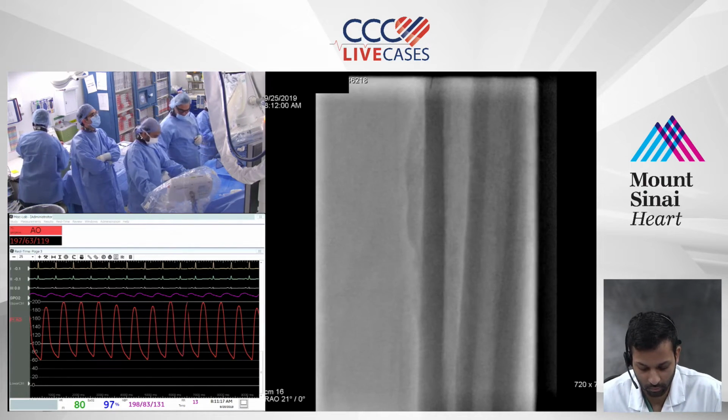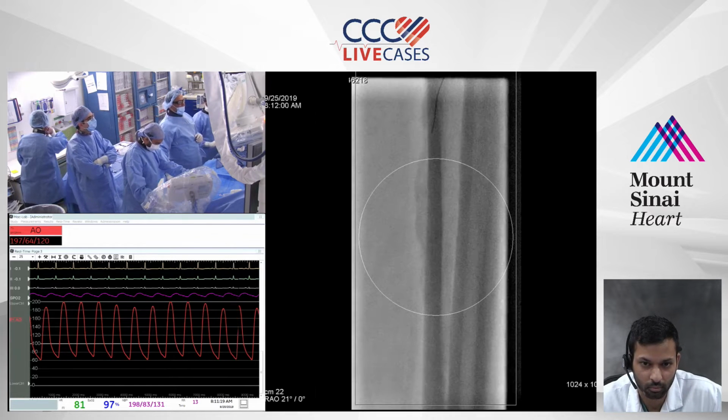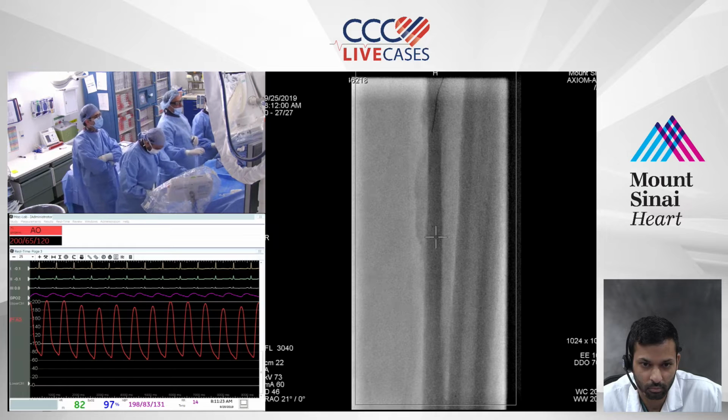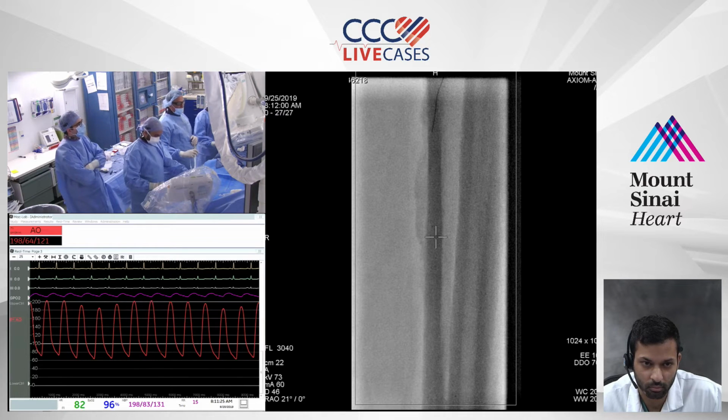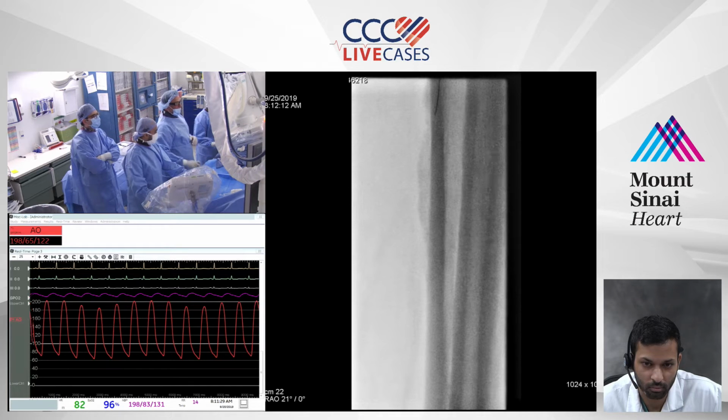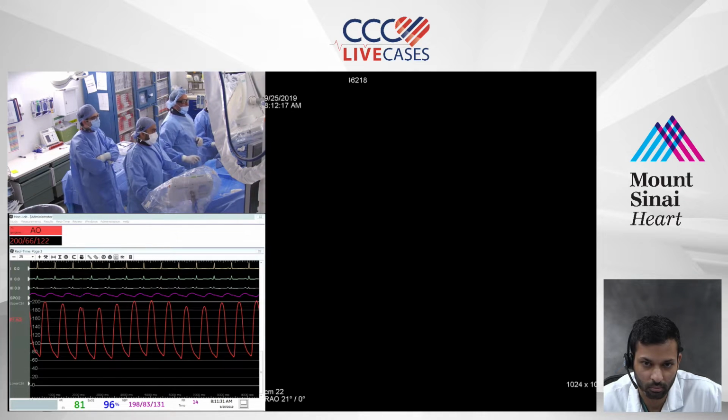All right, and is there a definition with ankle pressure itself? Is it below 30? Let's do a DSA. Is it below 30? What is the ankle pressure that we're looking for? Or below 70, 80, whatever it may be. Again, I just want to get our colleagues on the same page as you and me.